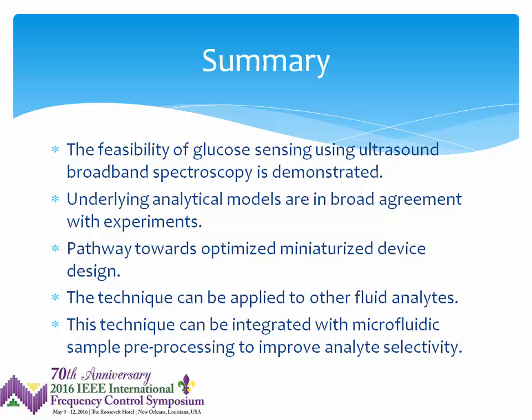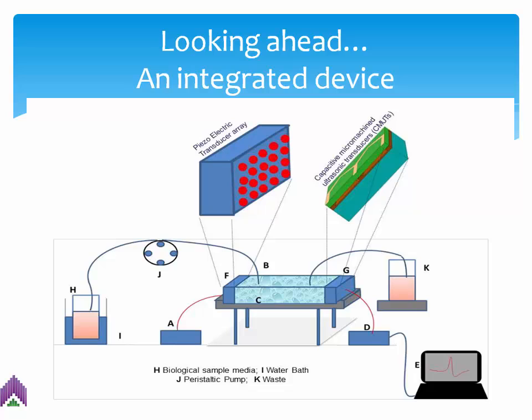Of course, ultimately you would want to integrate the transducers with the microfluidics, and then maybe integrate some sample pre-processing up front to allow you to get some contrast and selectivity to multiple analytes. So that's the plan looking ahead for Mega, is putting that all together.